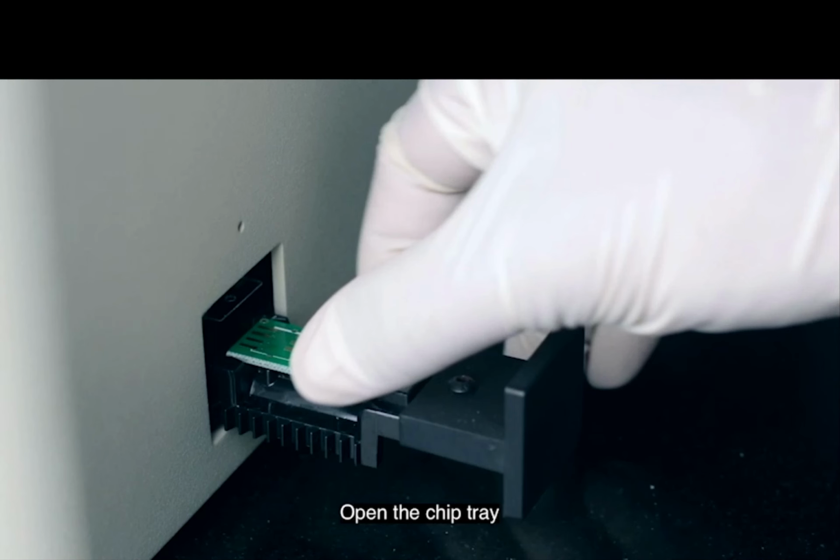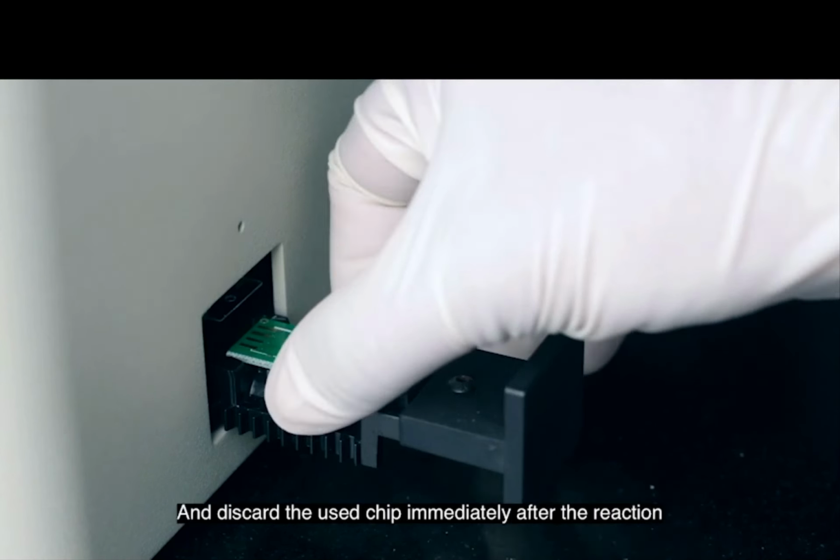So once the test is finished, it is important for you to take the chip and discard it. Put it in that 1% hypochlorite solution waste bin. Please don't put it on the surface, because if it is a positive sample and it is just lying around, that entire area will get contaminated. So you have to discard the chip in the 1% hypochlorite solution.